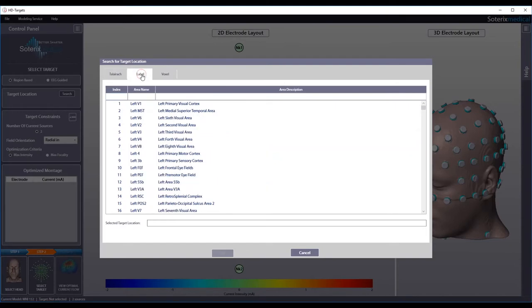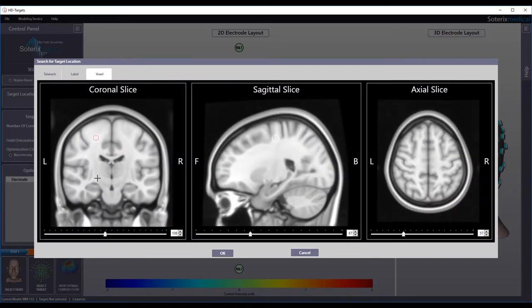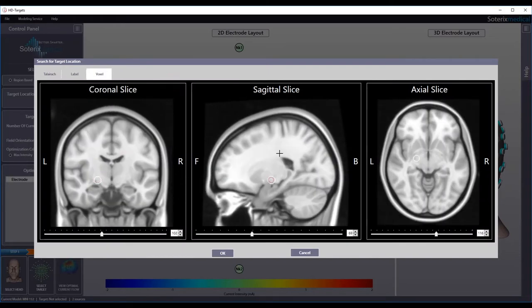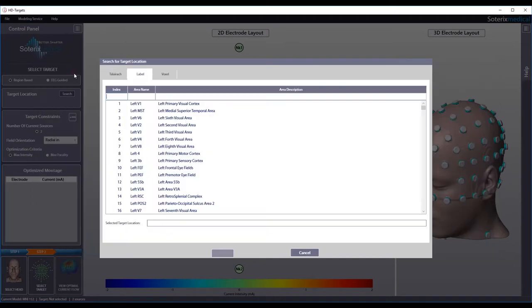For label-based targeting, you have 180 labels from the Human Connectome project to choose from. For voxel-based targeting, you can select any voxel as indicated by the open white circle in the 3D space to optimize for. In this demonstration, we will show you label-based targeting.